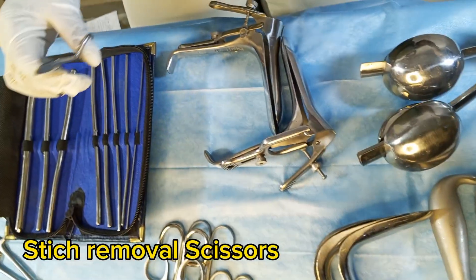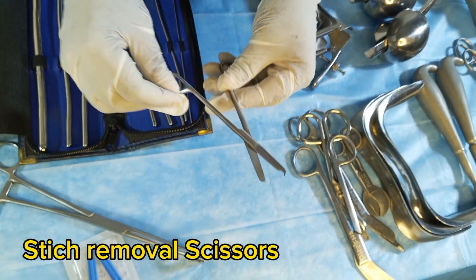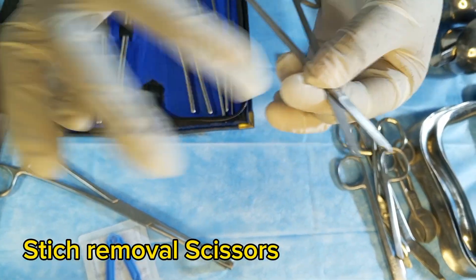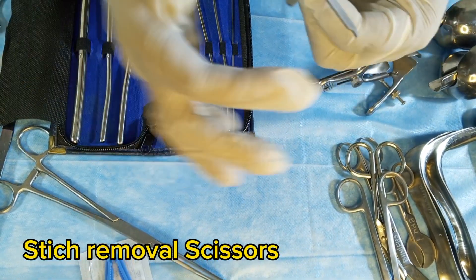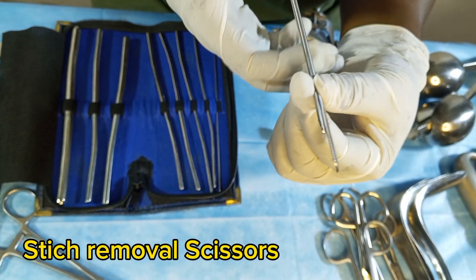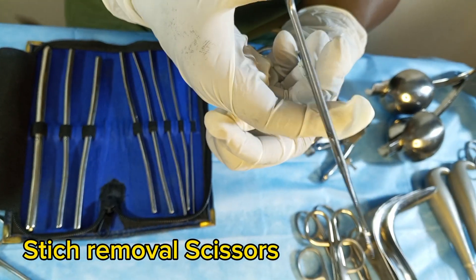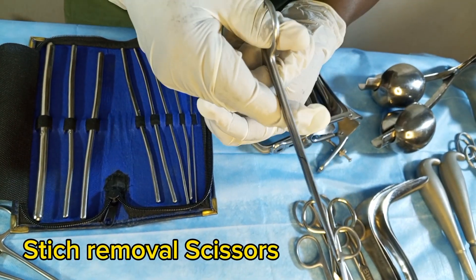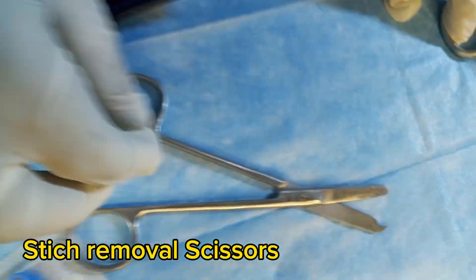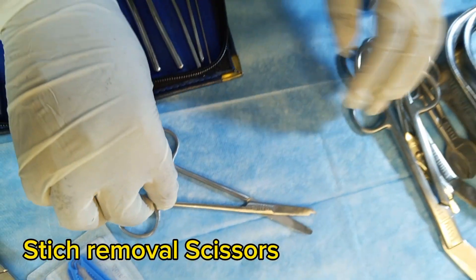Next is the stitch removal scissors. As you can see, one edge is straight while the other edge has a moon-like shape with a sharp tip, so that you can insert this tip inside the suture and cut it. This is what we call stitch removal scissors.